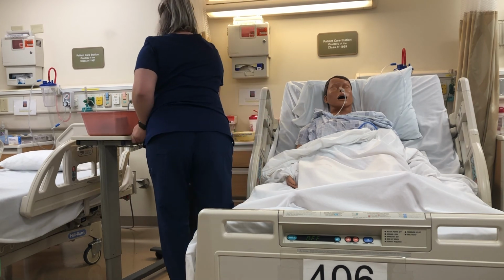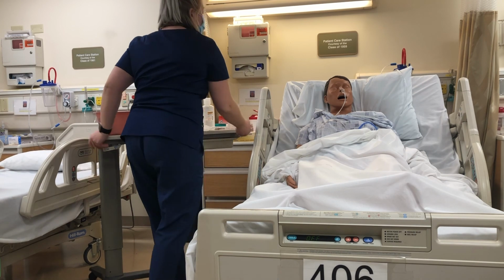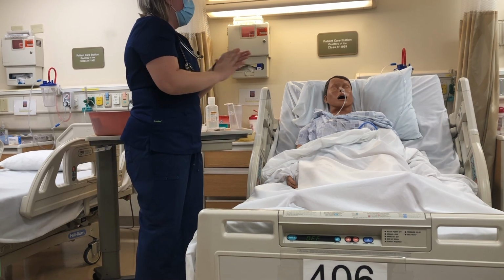Okey-dokey, everything sounds good to me. We are just going to wait until that x-ray team comes in and we'll go from there.